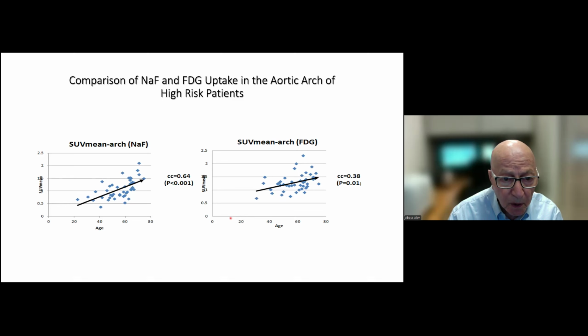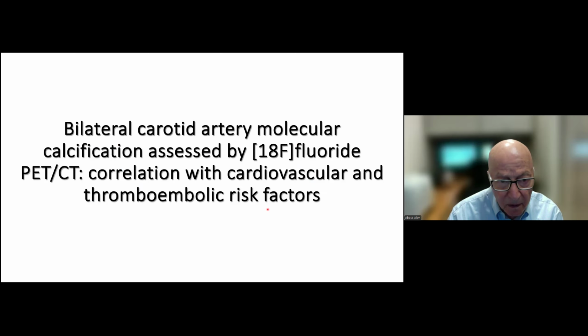This shows again sodium fluoride versus FDG in the aortic arch, and there's again a very significant change in sodium fluoride versus FDG uptake. This shows that molecular calcification is a good domain for us to assess the presence of plaques in various areas.